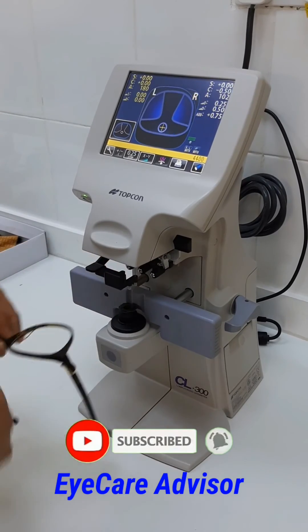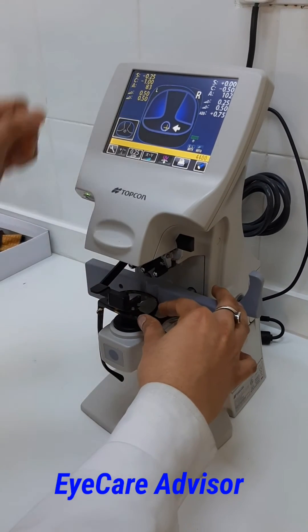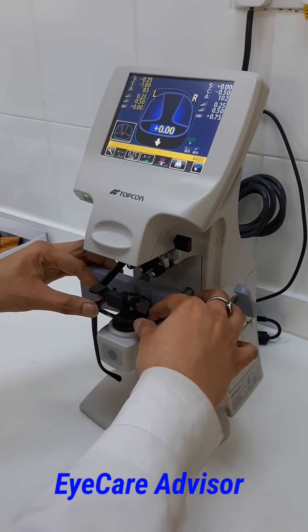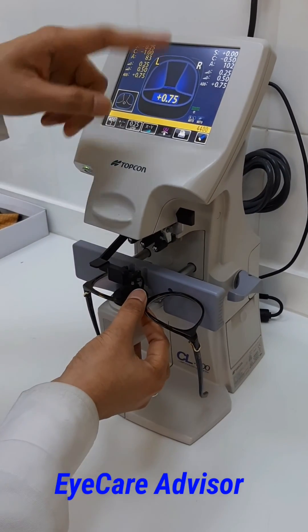The reading is 0.75. Now we go to the other eye — again we put the lenses in, put this down, and align it. The cross should come inside; only then will the exact reading come. You can see the distance prescription is already there. Put it down and accordingly you can get the reading zone. This lens is also showing 0.75.